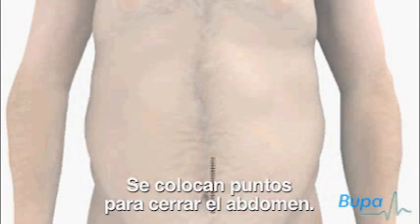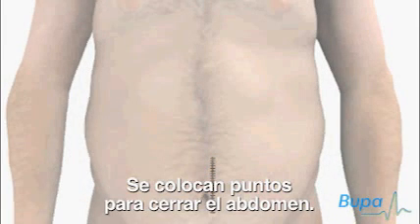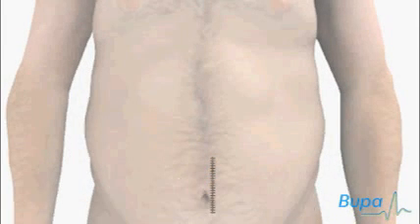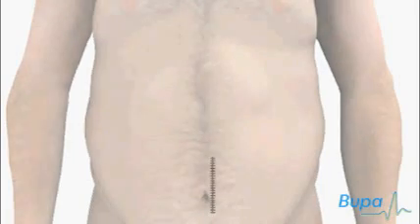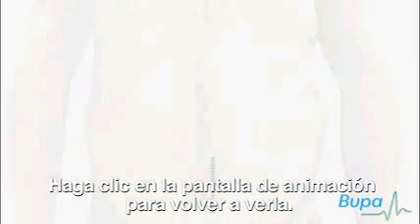The skin on the abdomen is closed with stitches. This is the end of the animation. Click on the animation screen to watch it again.